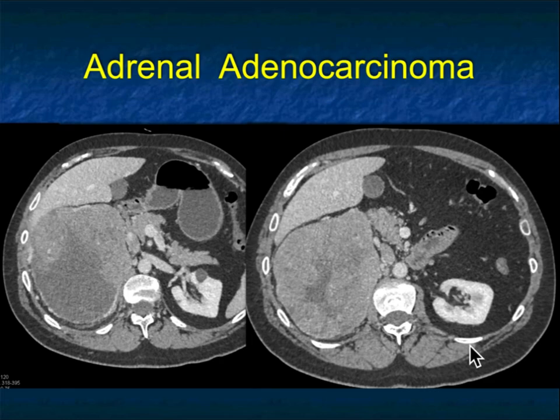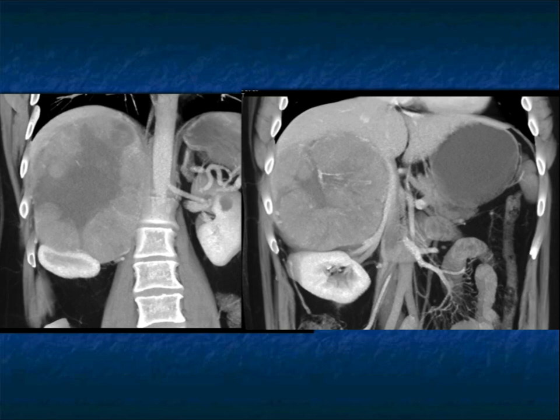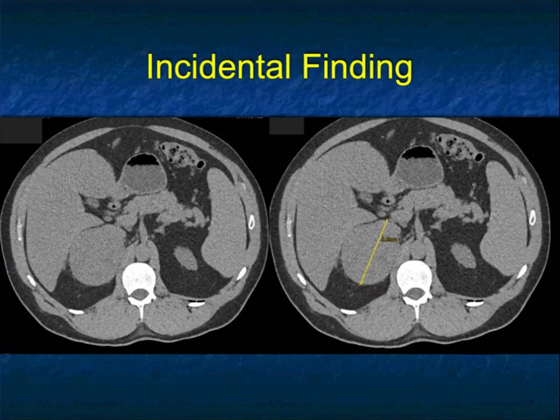Another example on the contralateral side — a large right adrenal mass that's enhancing but with areas of necrosis. It's large with some adenopathy present: primary adrenal cortical carcinoma. Here it is in 3D showing the central necrosis and some vascularity.